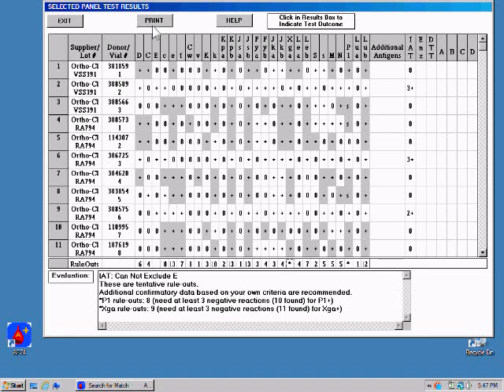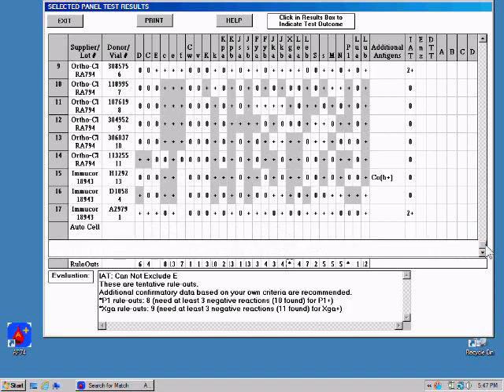The newly selected cells are at the bottom of the sheet. Using this worksheet, go and pull these particular cells out of the fridge, set them up for testing, and then come back and add your test results. And now, having used the search feature, we have complete evidence of anti-E.